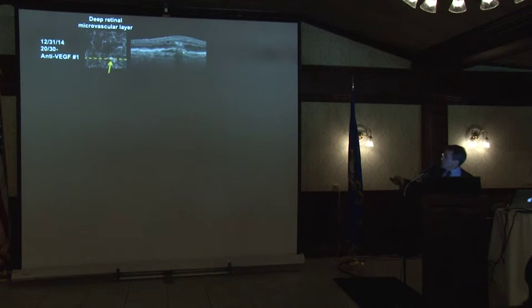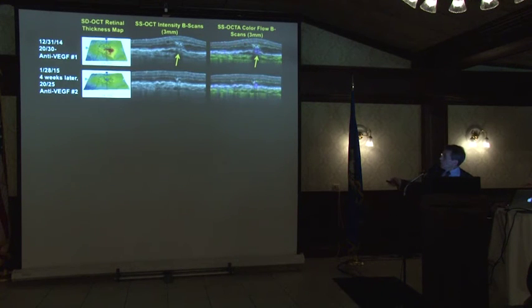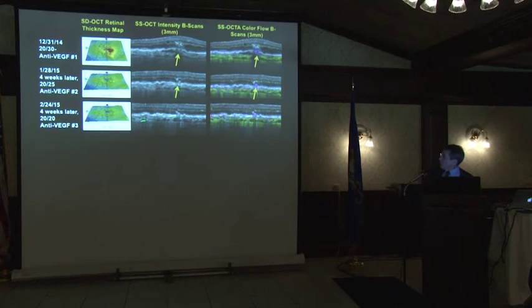So this is what it looks like. Here's the flow. There's the communication to the sub-RPE space from the retina. It's a primary retinal disease. And we treat, comes back 4 weeks later, beautiful, 20/25. Treat, 4 weeks later, 20/20.